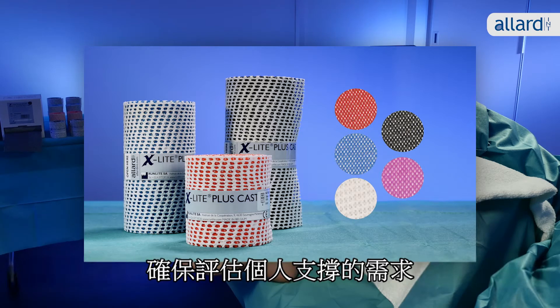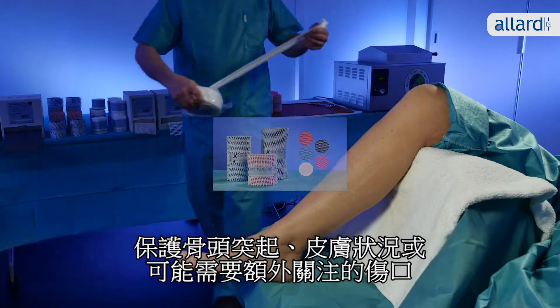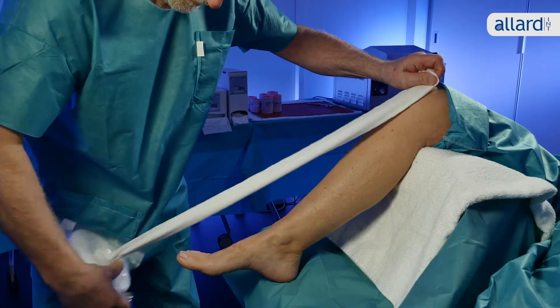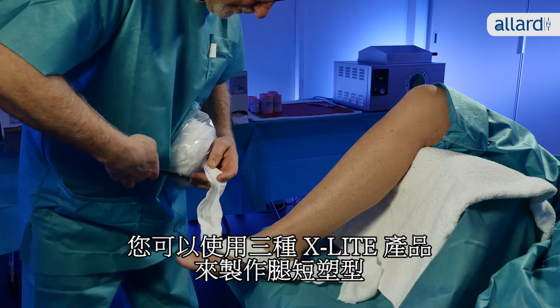Make sure to always evaluate the individual patient's need for support, protection of bony prominences, skin condition or wounds that might require extra attention. You can use any of the three X-Lite products to make a circular short leg cast.